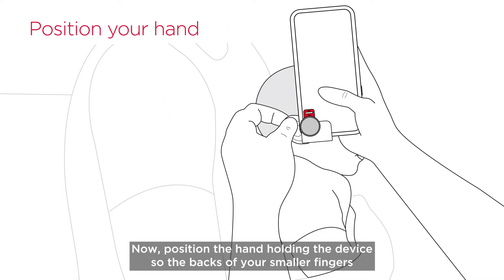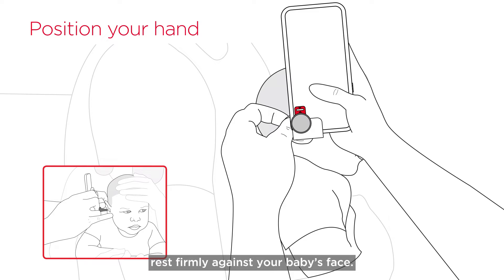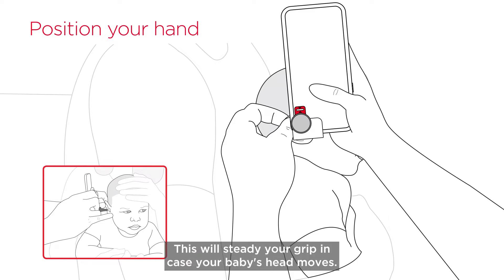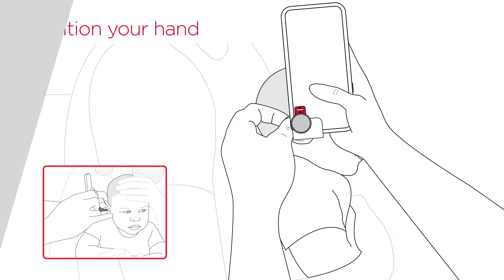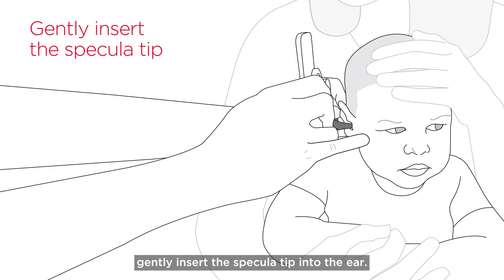Position the hand holding the device so the backs of your smaller fingers rest firmly against your baby's face. This will steady your grip in case your baby's head moves. Once your hands are properly positioned, gently insert the specula tip into the ear.